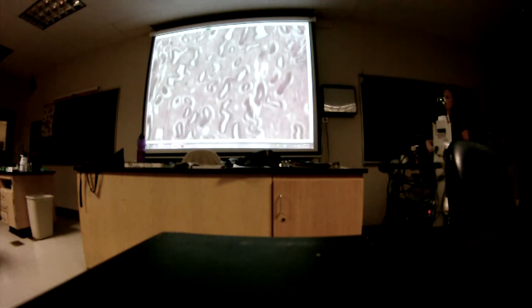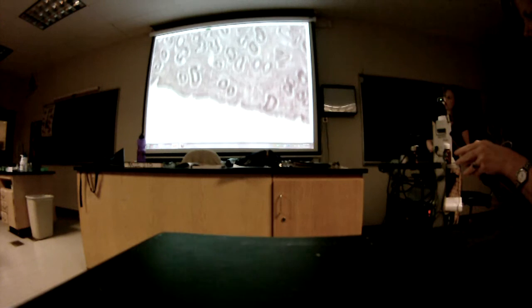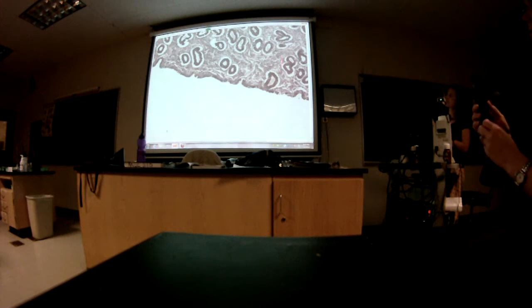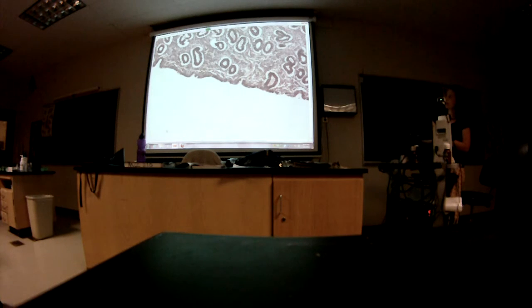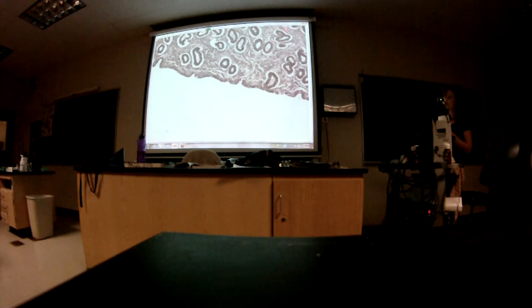And so on your slide, you're going to find the myometrium and the endometrium. So this is all the endometrium. Okay, this is all the endometrium you're seeing here. These are uterine glands. They produce mucus. Uterine glands or endometrial glands is the same term. And that's all within the underlying, this is all within the lamina propria.